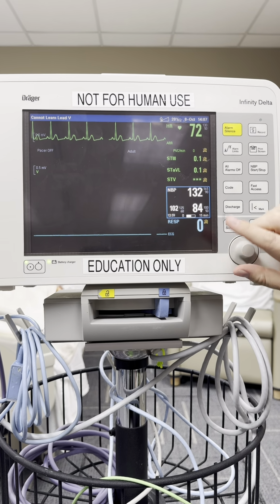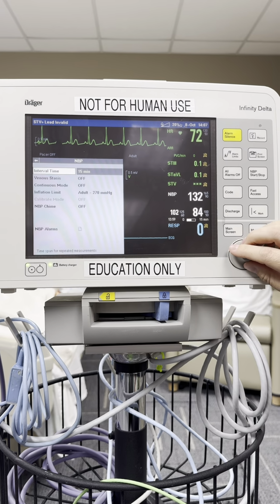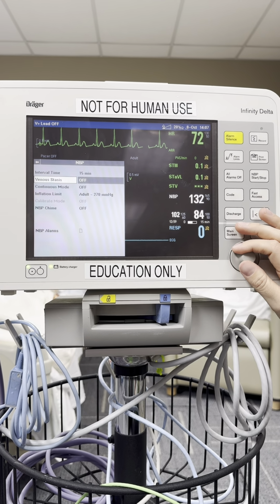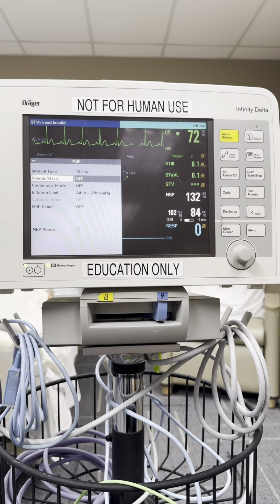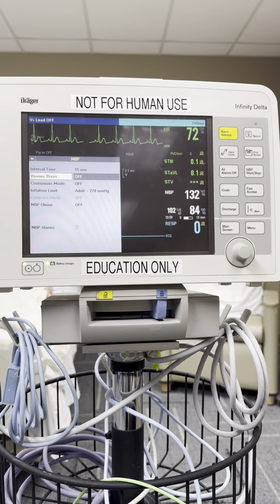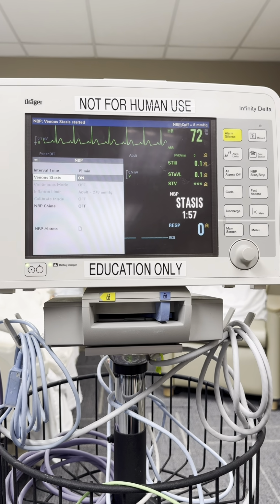Okay, the next thing, the blood pressure. If you click this, you've got your interval times where you can change how often you want them. The venous stasis option is pretty cool. If you've got a patient with a blood pressure cuff already on, you don't need to take that cuff off in order to insert an IV or straight stick them. You can just hit the venous stasis and this will blow up the cuff for 2 minutes.